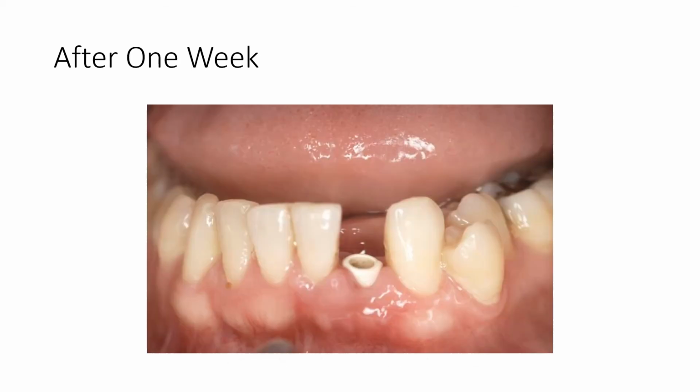So this clinical picture shows a transfer base in position. The case was an immediate placement which was placed a week earlier. The lateral incisor was extracted and an immediate implant inserted, and then a transfer base placed on top.